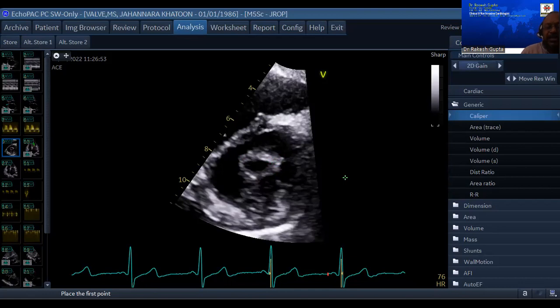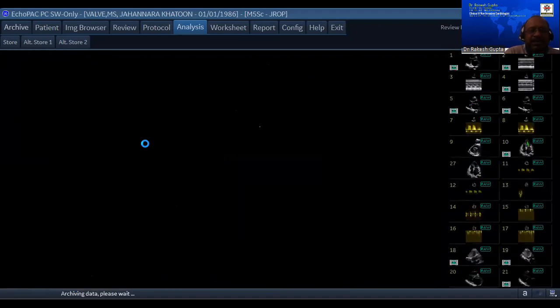If the gap is there, it means the commissures have been split, that is post commissurotomy. Otherwise, why would you have a gap in the commissures? Okay. Is that right? Yes, sir. And then what is the normal view? Can you show that normal? I showed you normal a little bit earlier. Okay, I'll show you in some other patient. Just give me a second.